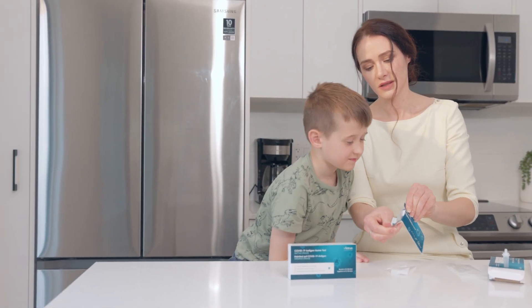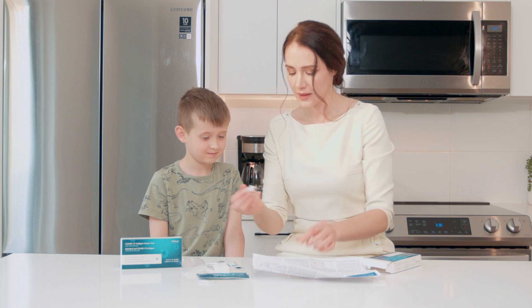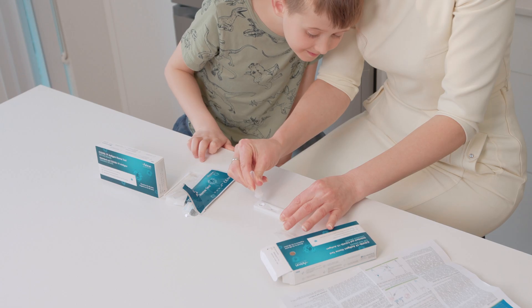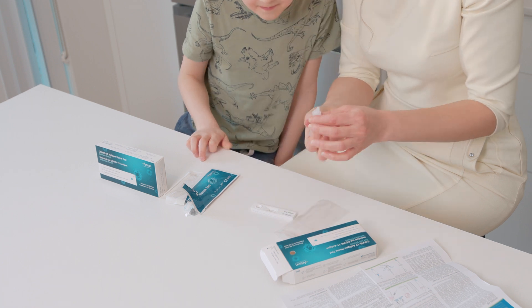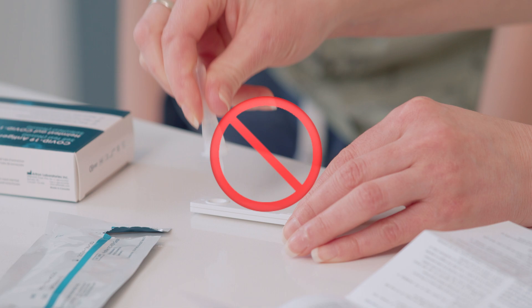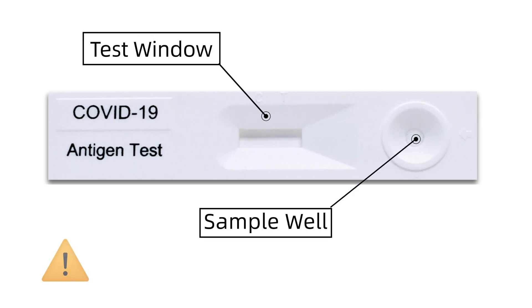Remove the test cassette from its sealed pouch and place it on a flat surface. Fill the sample well on the test cassette to the designated line, which is usually about a half a dropper full. Or, simply add four drops of the specimen into the well. This will activate the test and give you the most accurate results. Be careful not to touch the card with the dropper tip, nor touch the test window and sample wells, as these may prevent accurate readings.